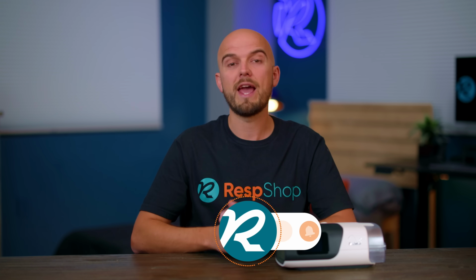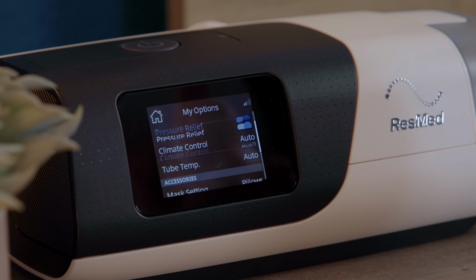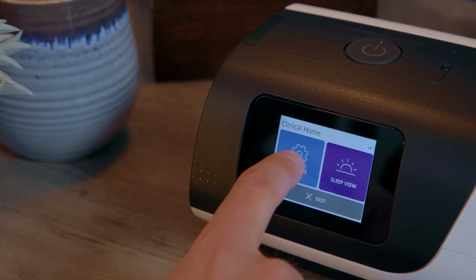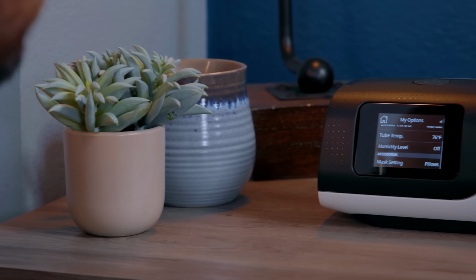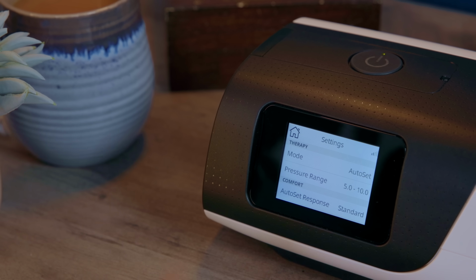Now, you're probably aware of the My Options button on the home screen, which lets you make some adjustments to your settings. There are some comfort settings on there that you can change, but there are more comfort settings and more options in the hidden clinical menu for this machine. So I'm going to show you how to access that menu and make more refined changes to your comfort settings.